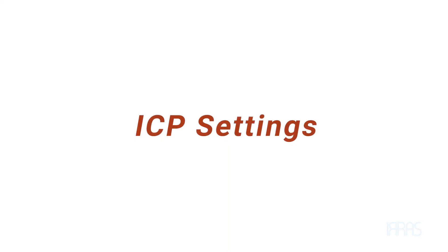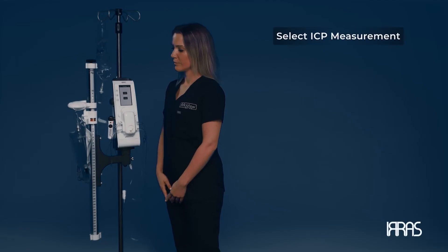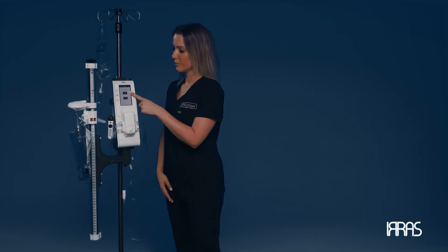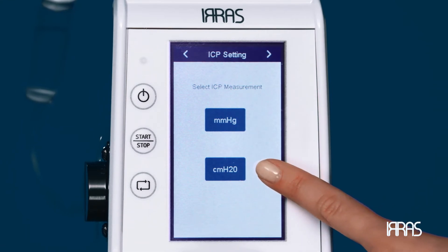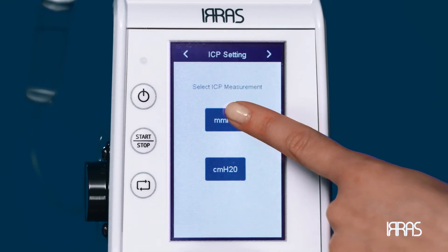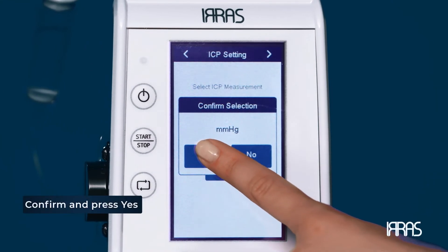ICP settings. Select your ICP measurement unit — you can choose between millimeters of mercury or centimeters of water based on facility or physician preference. Once selected, confirm you have chosen the correct option and press the yes button on the screen.